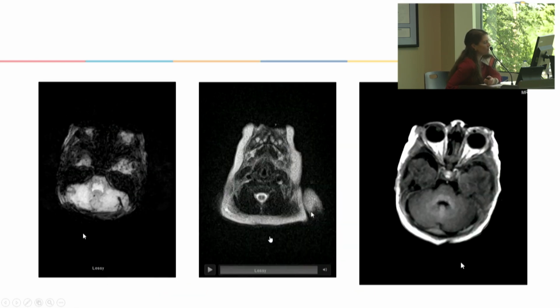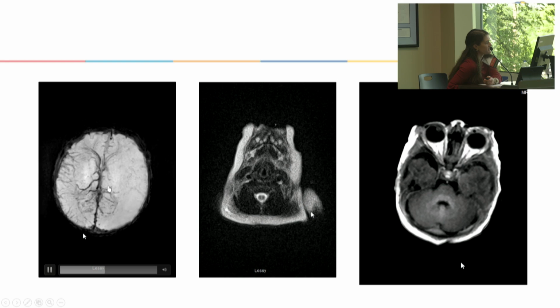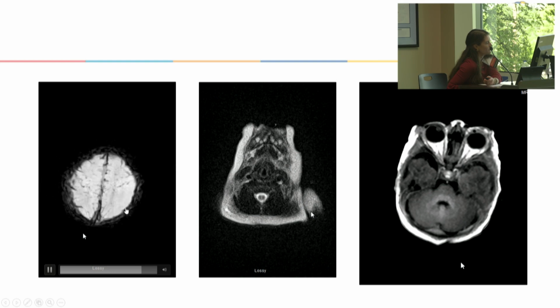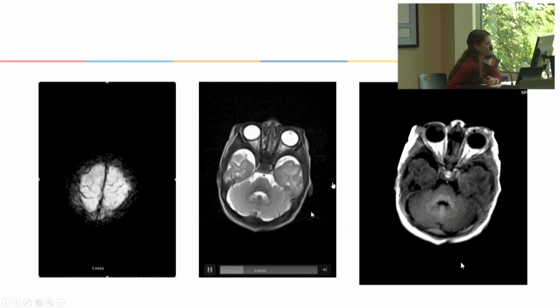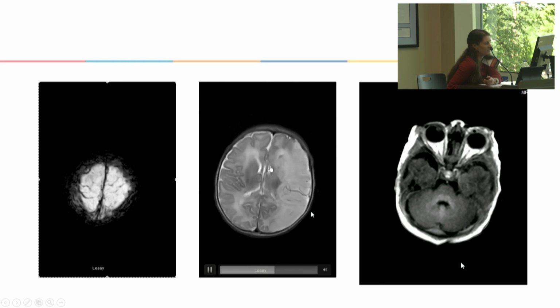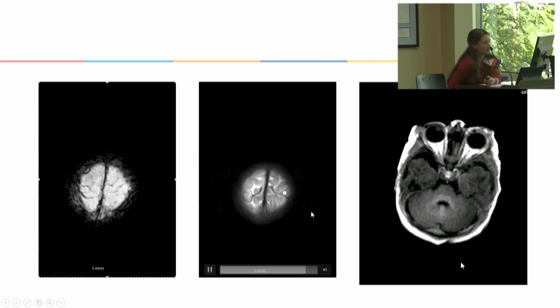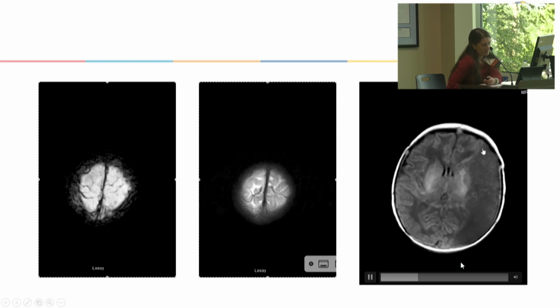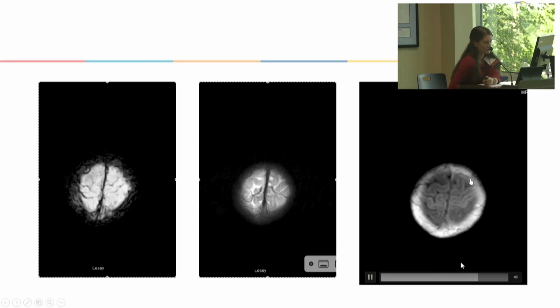And so just to go along with this same case, this is the SWI imaging, right? So you can see that paucity again of blood vessels on that side because of all the edema, whereas you see all of his veins on that other side. This is T2, water's bright. So T2, the changes after acute injury are going to take a little bit longer to show up, but you can see that's all the increased water content, right, and the edema is making that brighter. It blurs out the gray-white matter junction. And here's T1. Again, edema, water, graying out, or blurring of the normal brain structure.